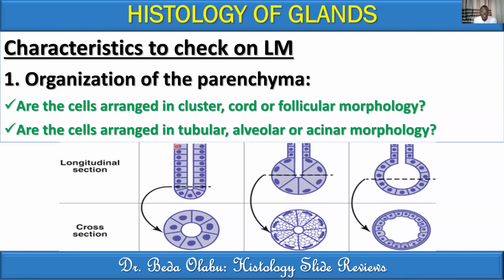So for tubular morphology, there's no major morphological difference between the ductal and the secretory part, because the secretory portion is not ballooning out. For the acinar morphology, yes, the secretory portion balloons out, but the cells are very long and prism-like, and so the lumen of the secretory portion is still tiny.